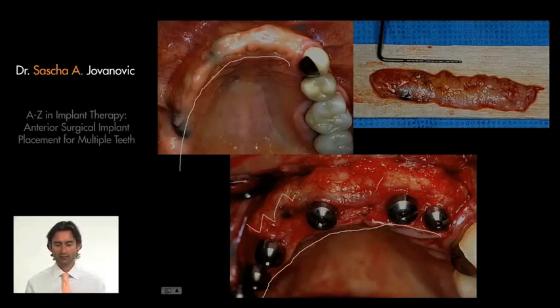And this area will now allow me to thicken the buccal side. So this is quite nice because it demonstrates to me almost like a recycling treatment, taking soft tissue from the palate, moving it to the buccal to thicken the area.